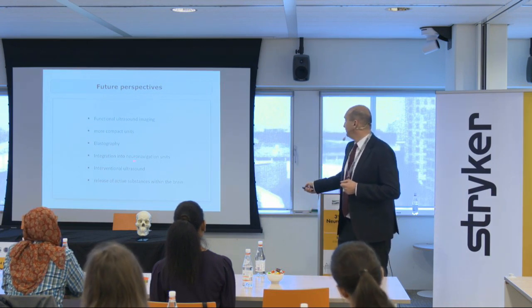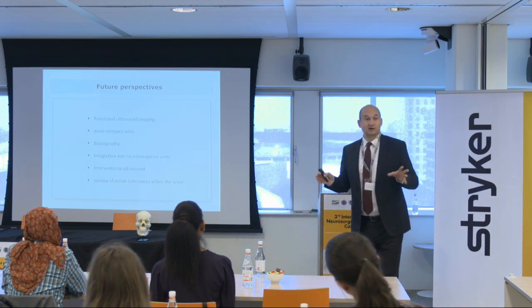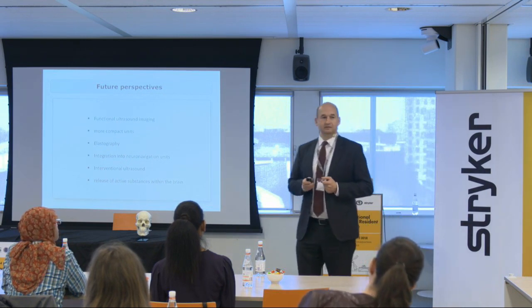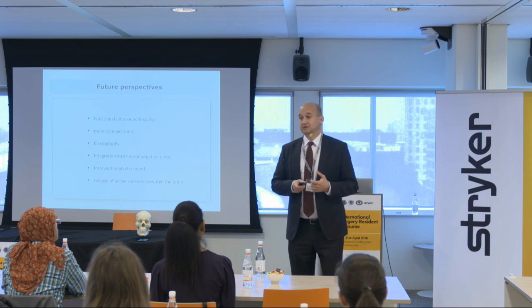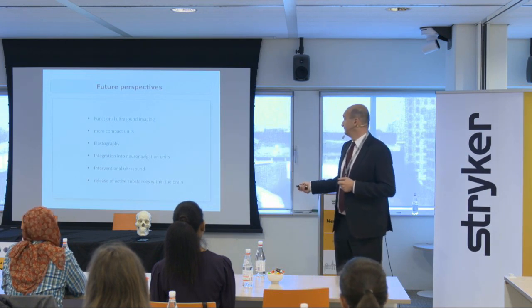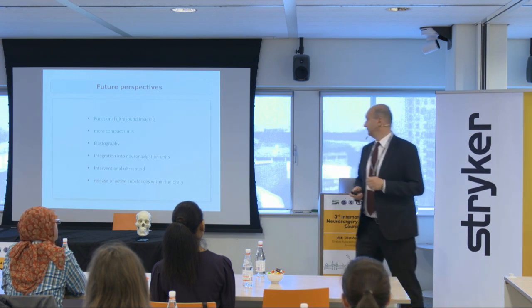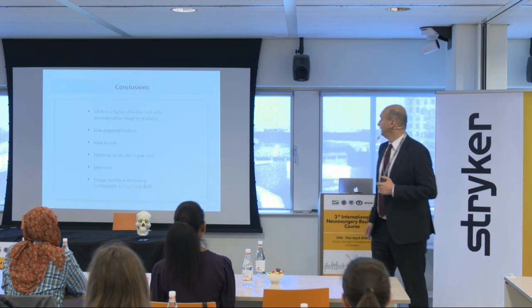Interventional ultrasound is now very en vogue. No one really knows in which way that's going to develop. It's definitely not much of a competition to, say, deep brain stimulation techniques, but it can be used to treat Parkinson's. It's irreversible, and that's part of the problem of this technique. And that's my last slide here.